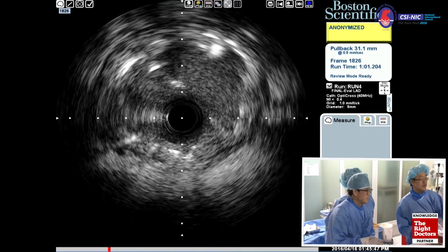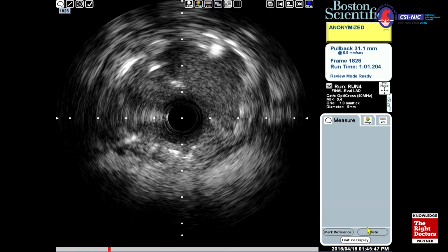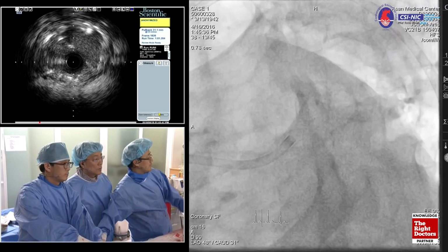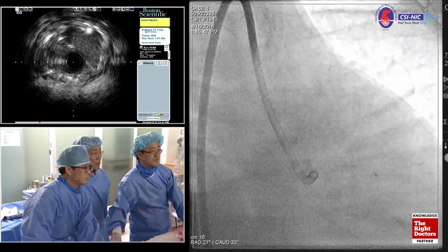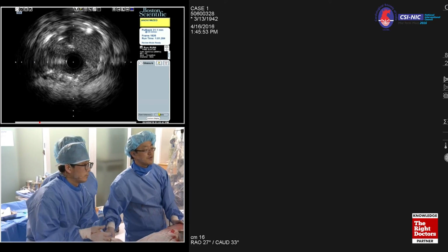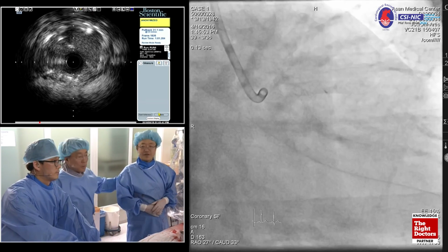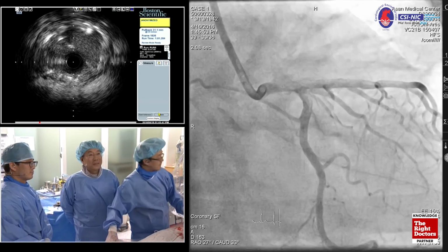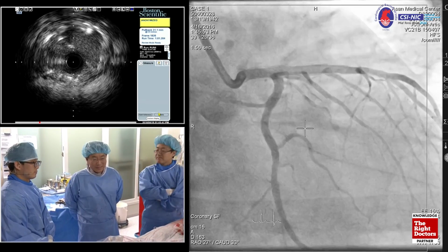Okay. Great. Shoot. Okay, great. And then area quarter. So, okay, great. Okay, final shot. Oh, I like it. It's great. Yes. So, Dr. Bob, good job. So, what do you think? Yeah, looks very excellent result. It's very nicely done.